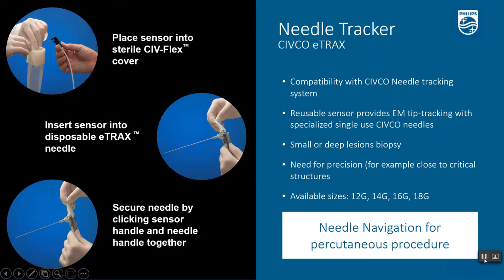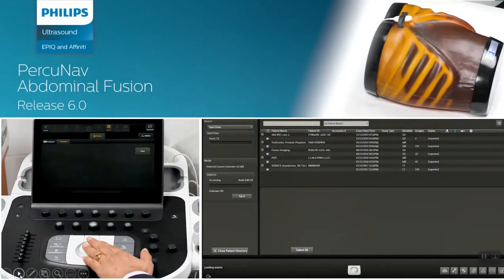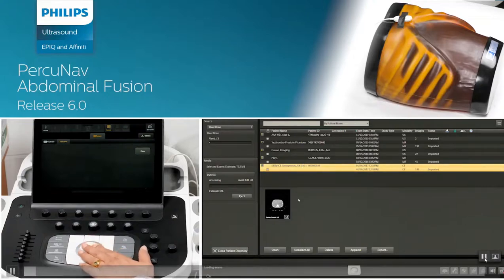Now let's see the demonstration of fusion imaging. In this demonstration, I am using historic abdominal CT contrast data and will use auto-registration with the vessel-based technique.